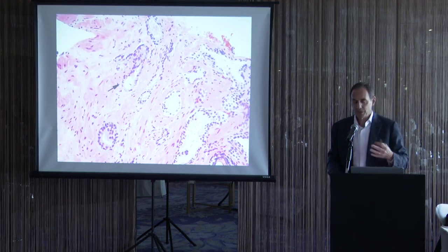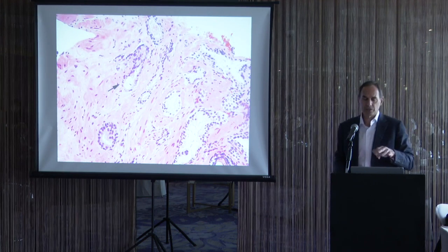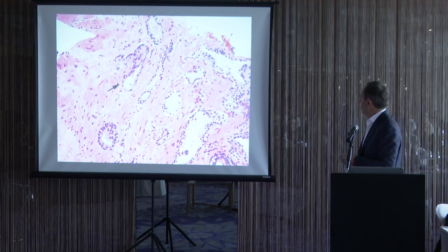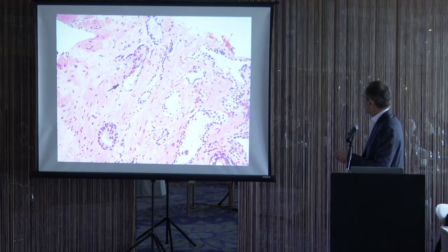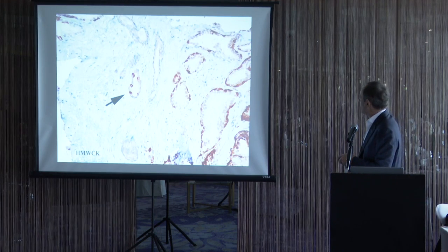And then we have some prostate cancers, as I mentioned, that can have non-specific staining for basal cell, but not in a basal cell distribution. So these are benign glands here. These are cancer glands here with this amphophilic cytoplasm, and I'm going to focus just on this cancer gland. So here, this is the high molecular weight cytokeratin stain.